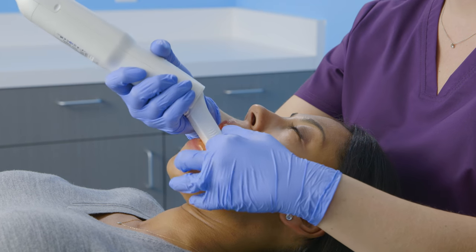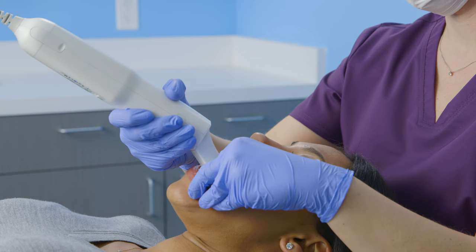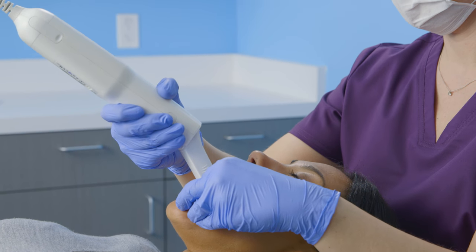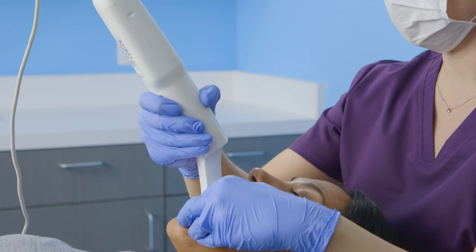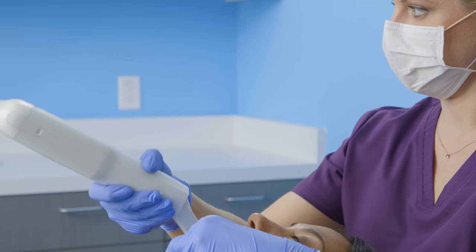When I'm scanning the occlusal surface, I am careful to orient the cable end of the wand away from the patient and bring it straight out of the patient's mouth without twisting or turning the wand. As I scan, I will bring the wand around the arch, maintaining this orientation.